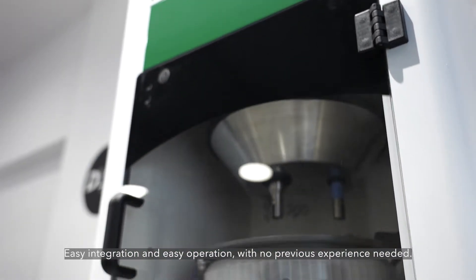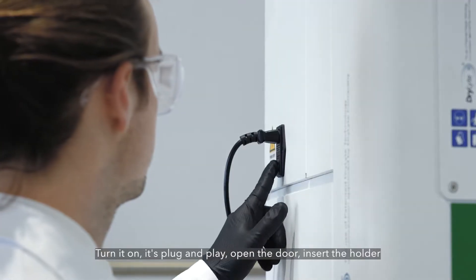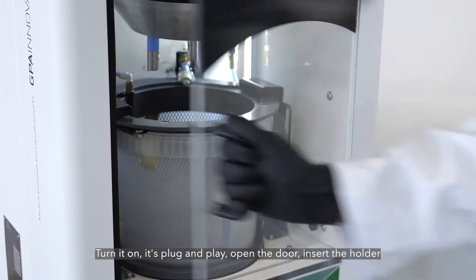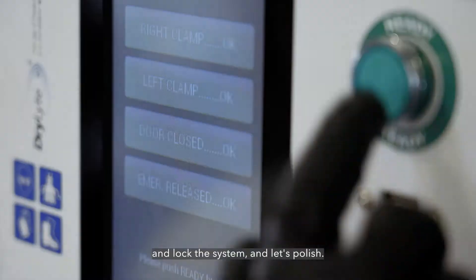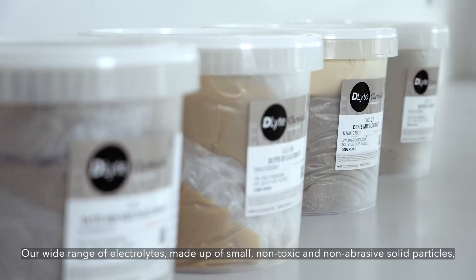Easy integration and easy operation with no previous experience needed. Turn it on, it's plug and play, open the door, insert the holder and lock the system and let's polish.